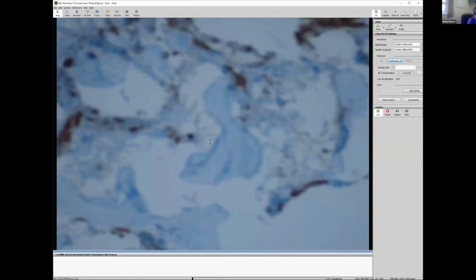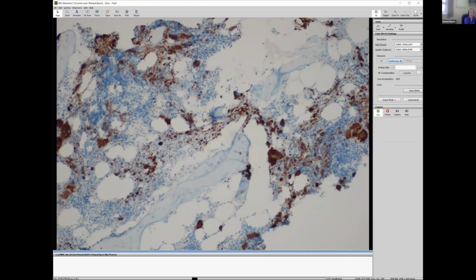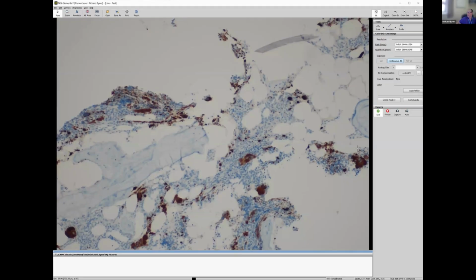So you can see this really highlights how much megakaryopoiesis there is. Absolutely tons and large atypical clusters. So the preferred diagnosis for this one was cellular phase myelofibrosis, because it hasn't really established that full-blown grade 3 reticular fibrosis, but it's being driven by still the increased megakaryocytes.